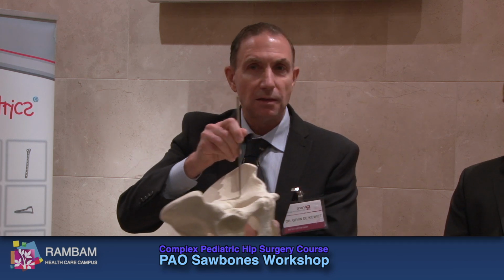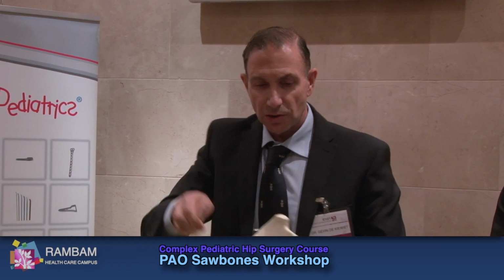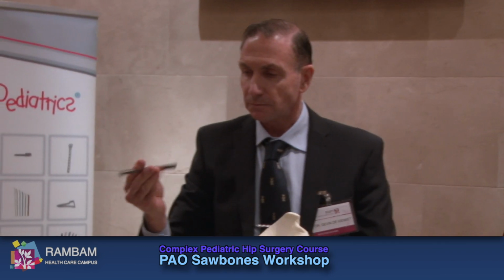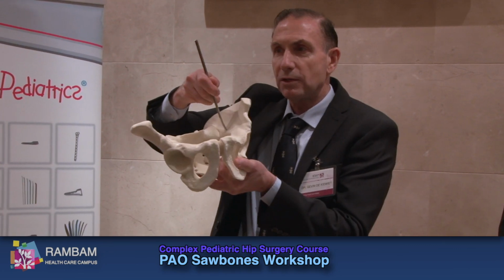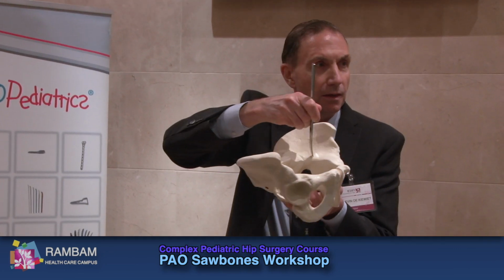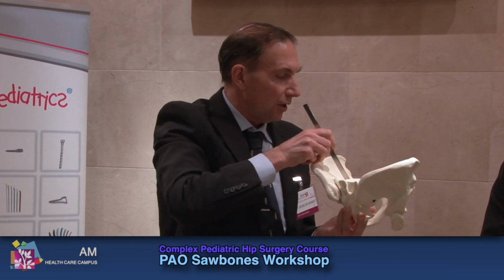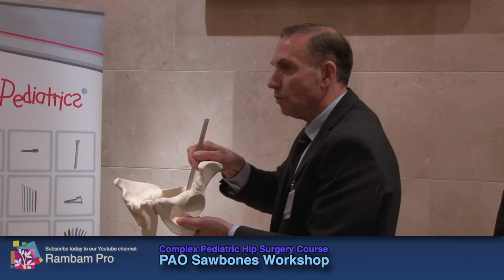When you hit that point, you want to do 120 degrees in one direction. So you take your osteotome, take a 1 centimeter osteotome, right like that. That's about 1 centimeter from the brim, put it in the hole, and rotate 120 degrees this direction. Okay? And then I'm going to cut just the inner cortex. So I'm going to start going down the inner cortex like this, and this is what you see. You don't see very much, inner cortex.